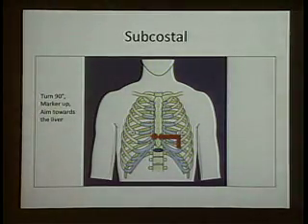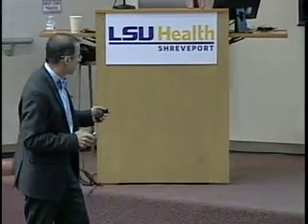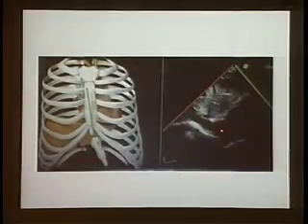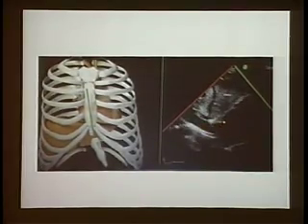So what do you do with your subcostal view? You move your probe now, the marker that was pointed towards the left shoulder, you move it towards the ceiling, okay? And that's going to give you a modified version of this view, which is going to give you the entrance of the IVC into your heart. So you see the confluence here of the IVC and your RA.